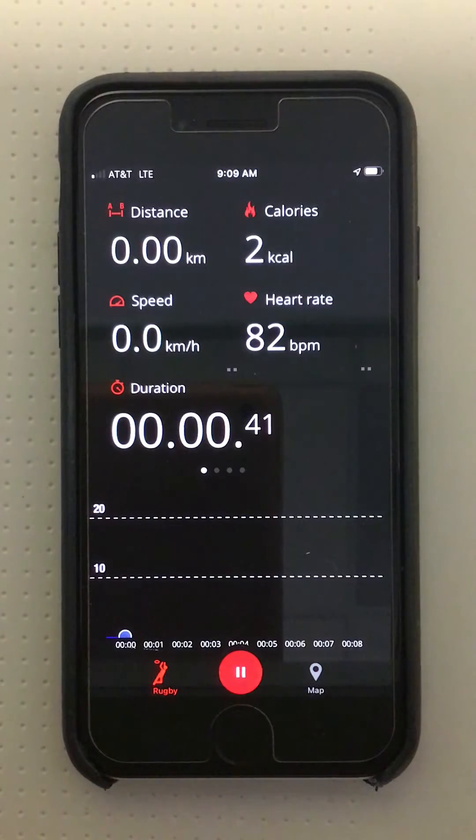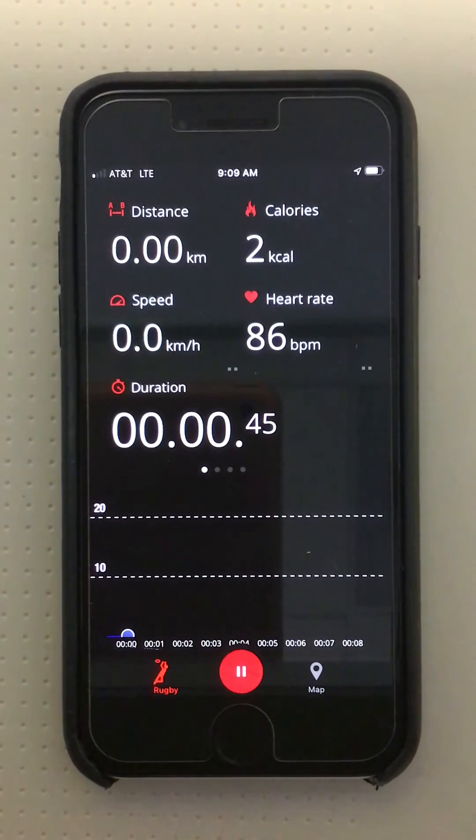It will transition to a blue color once the patient reaches the 60% heart rate max zone. At 70% of heart rate max the text will transition to a green color, and when the text changes to green I know that we have now entered the targeted high intensity training zone.